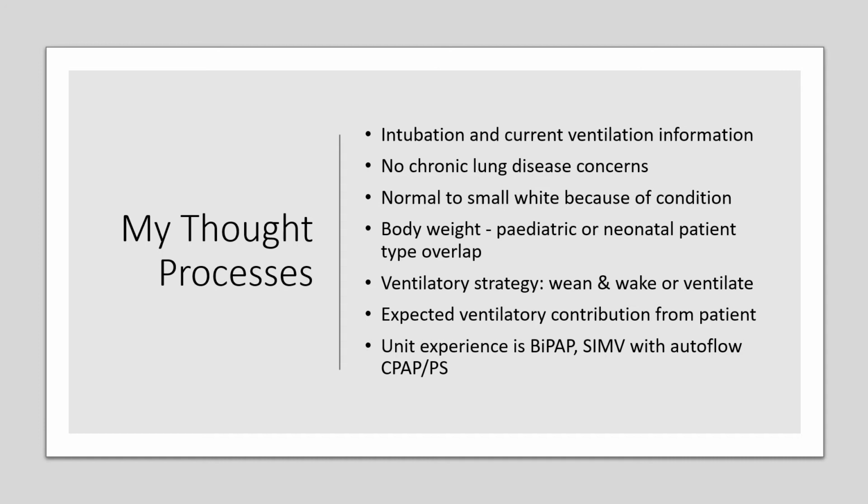You need to think what sort of ventilatory contribution you're getting from the patient, and obviously if it's a wean and wake, you would expect that they're going to breathe very quickly, and therefore will benefit from a synchronous spontaneous mode. Or it might be they're sick and they need to stay asleep a lot longer, in which case you wouldn't necessarily think in those terms.